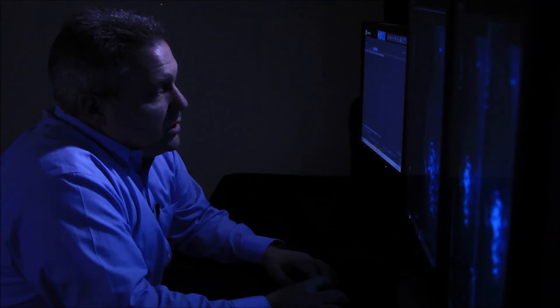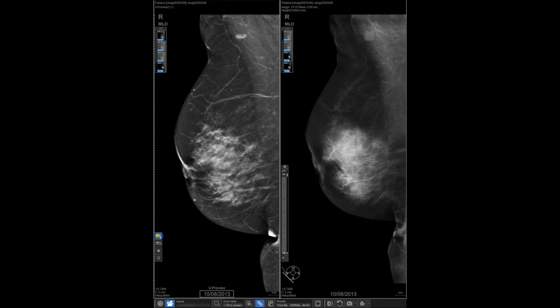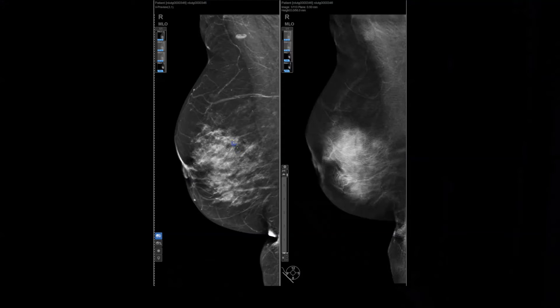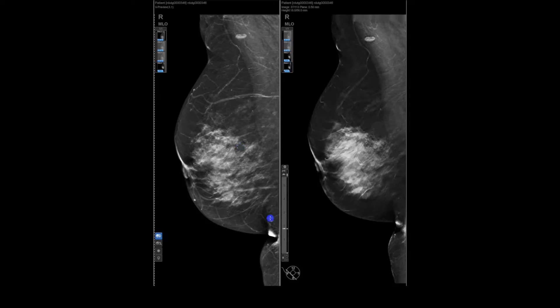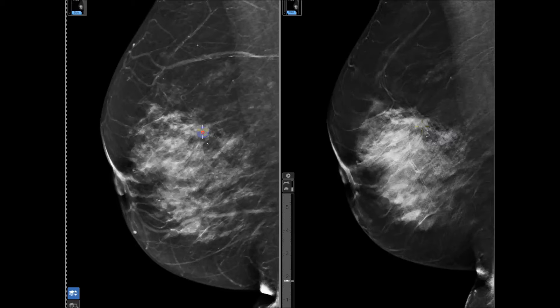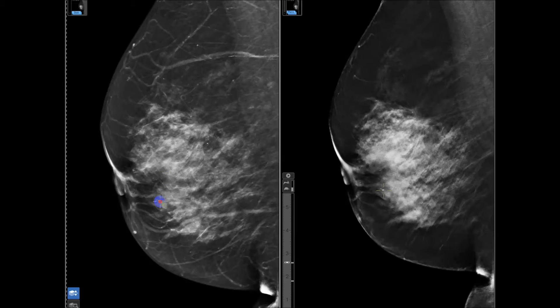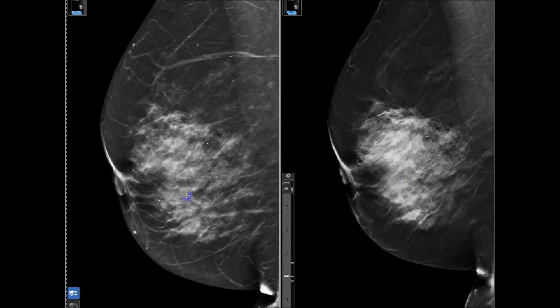We have a tool called the volume preview navigator, and it's described that way because it helps us navigate. If you pick a finding or a point on the image — which is basically this 2D image — you can go ahead and click on it, and it will take you to the corresponding place in the volumes, the planes and slabs, where you can really define it a whole lot better. Right now I'm looking at an area that I think I would have found on the volume preview alone, but I get a whole lot more data if I actually look at its representation in 3D.